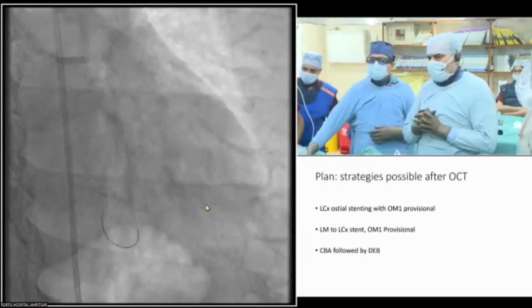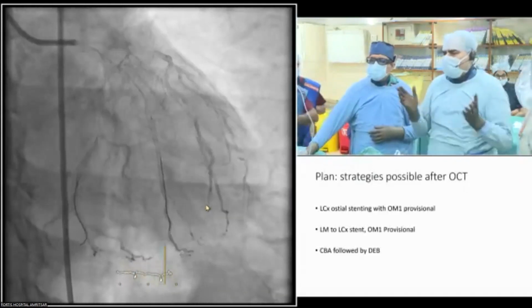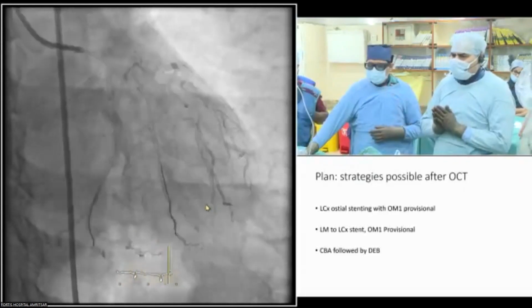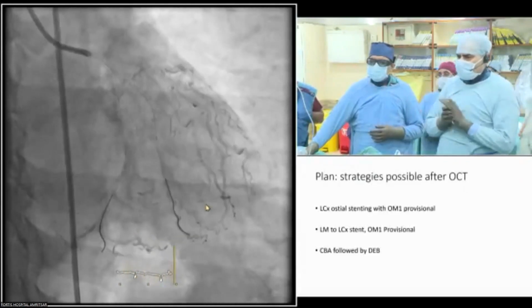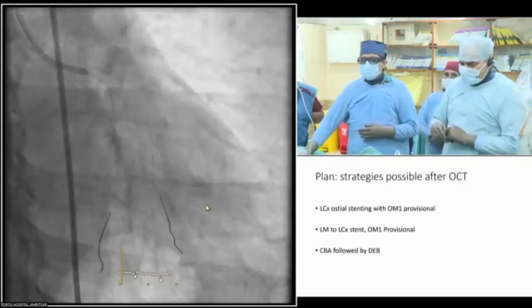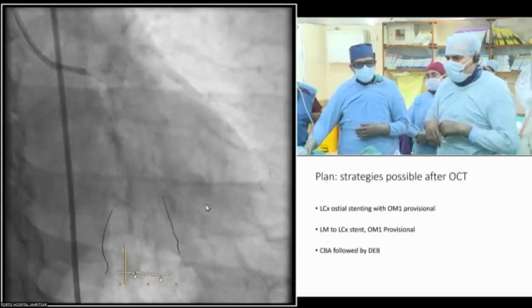Now we are committed, but even now I think it's not too late to do FFR. If FFR is okay, just do a drug-eluting balloon. What I am thinking is we do FFR, and if FFR is decent, then we can do a drug-eluting balloon and leave. Yes, that's a reasonable option. Okay, let us do that. So maybe you can visit one of the other centers for 10 minutes while we do all this.